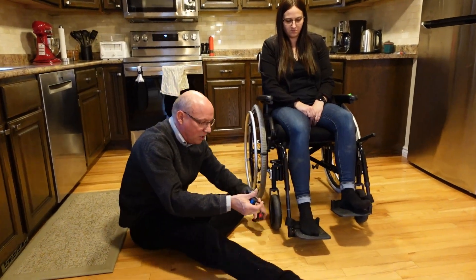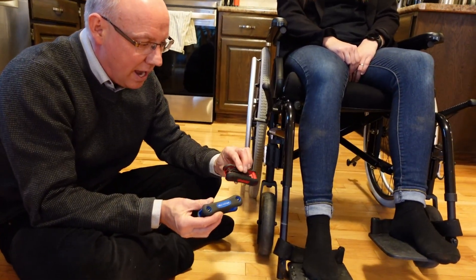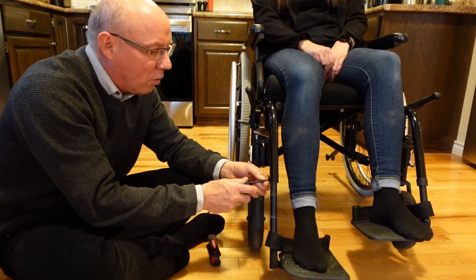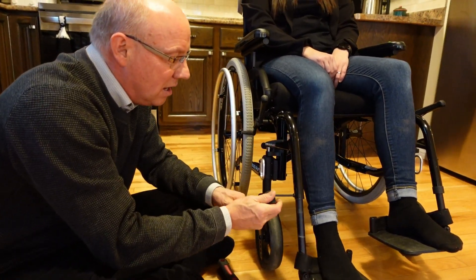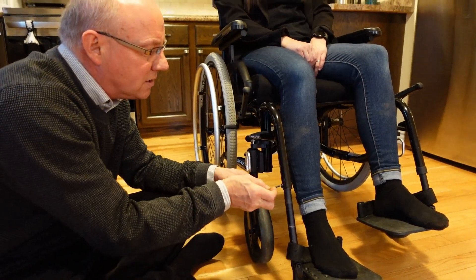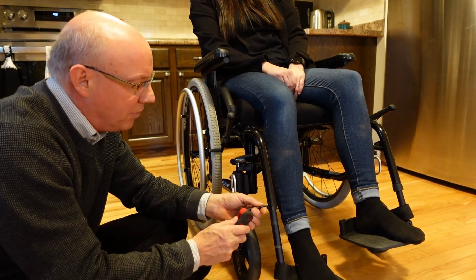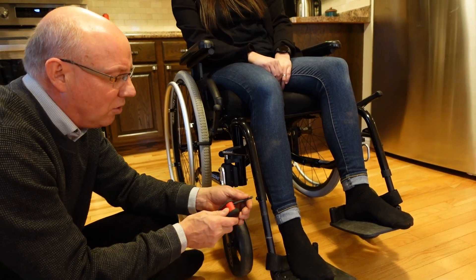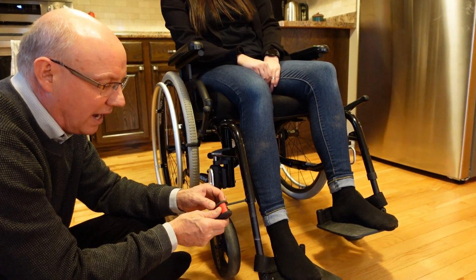So on this particular case, you've got two different types of Allen keys — metric and standard. What you need to do is find out which one is actually going to work. This one is nice and tight, this one here is nice and tight. The next size up is too big — you can see there's too much play. You'll strip the Allen key, and there's nothing worse than that.